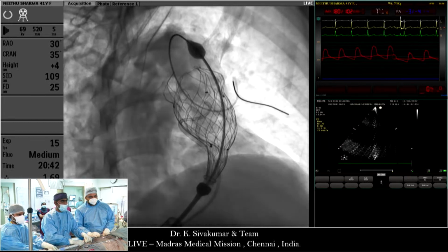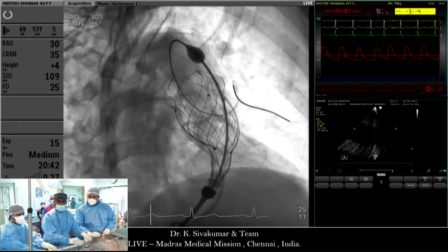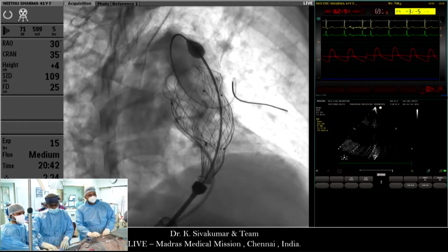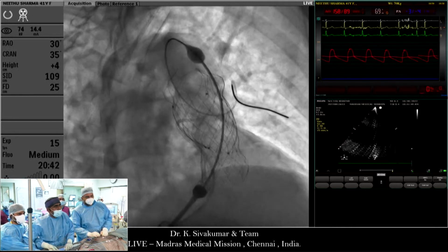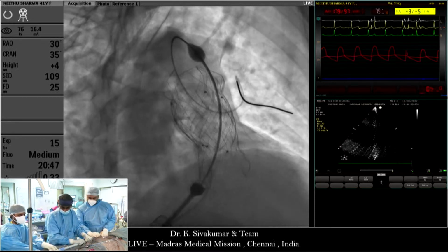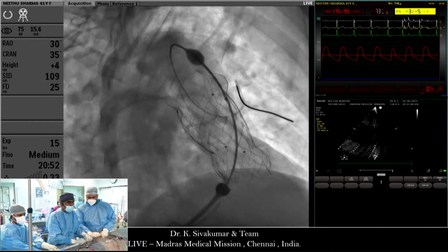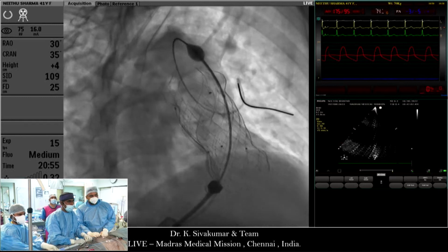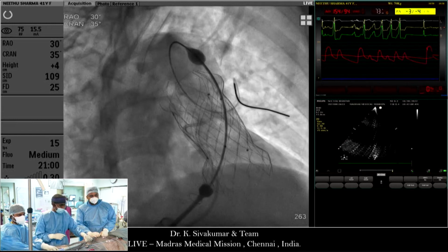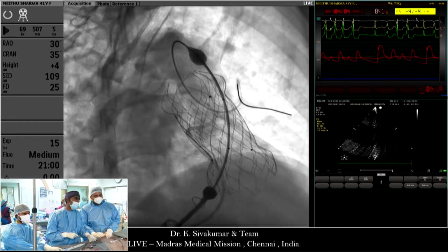Angio. Angio. Yes. Lovely. Okay. I think this is the place. Okay. Now further rotate. Slowly. Rotate. No need to rush. Rotate. Okay. Now give one more angiogram. See what you think now. Actually, my pigtail is outside, but I will just see. Ready? Yeah.